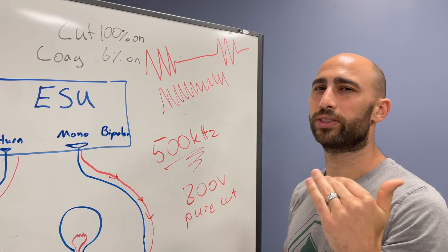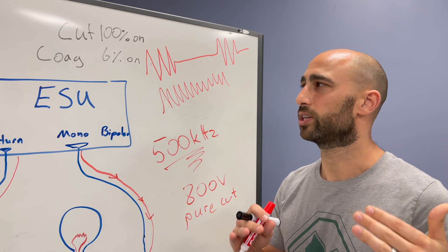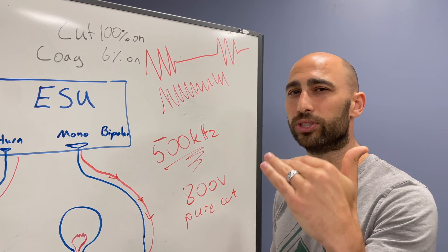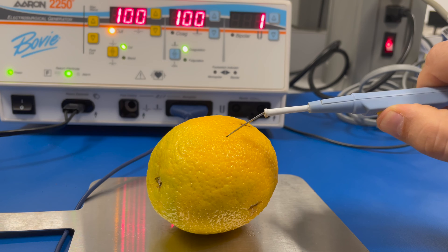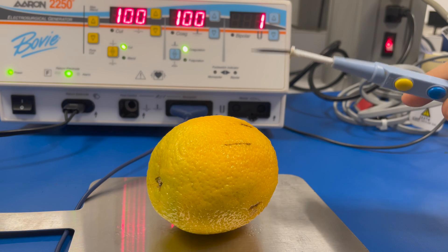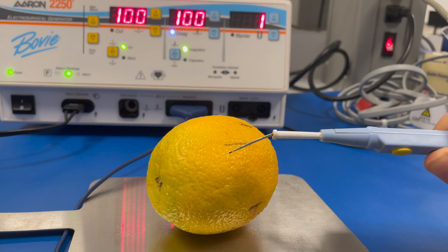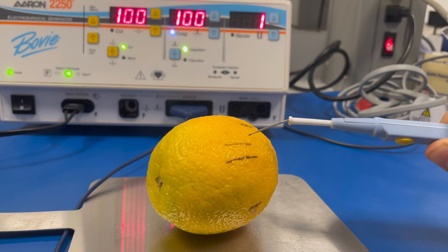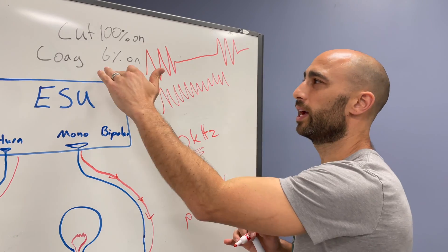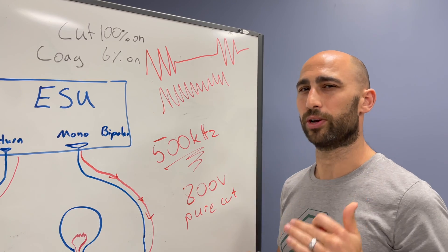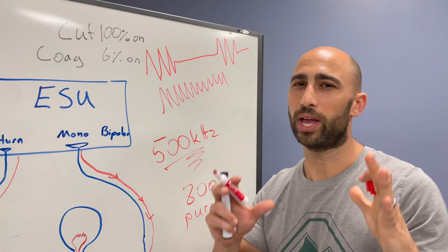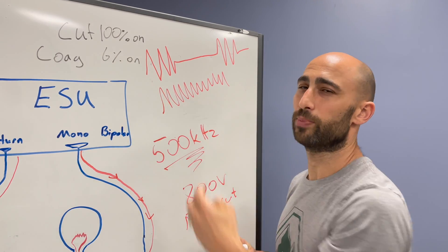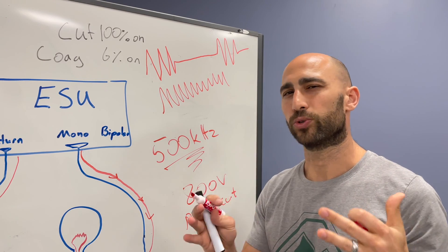For deeper cuts, cut mode is better — it's at 100% on and lower voltage, which penetrates deeper into tissue. If you are trying to desiccate or use fulguration, coag works well because it has that higher voltage. Let's take a look at the difference between cut and coag on our orange — here you can see cut at 100 watts, and now coag, with a lot more surface effects. A blend goes somewhere in between: instead of 6% on, you might do 10% or 20% on, and that's your blend function.